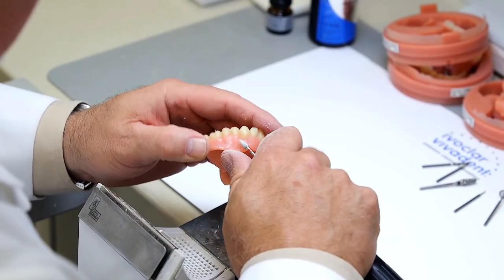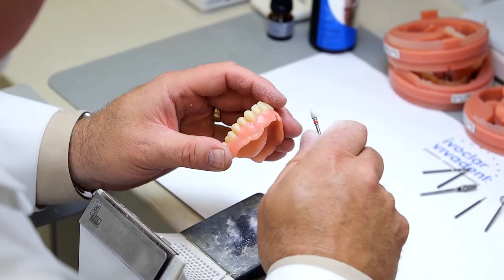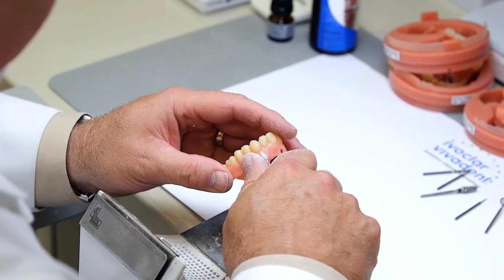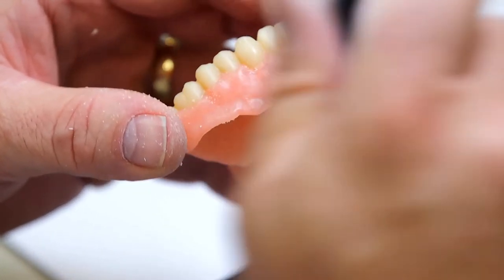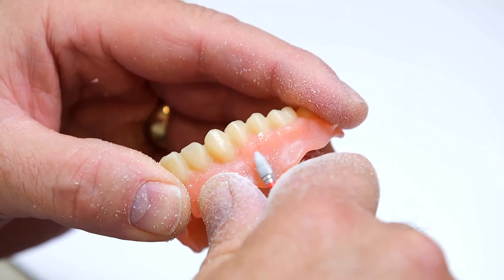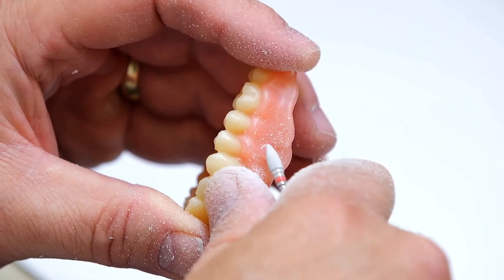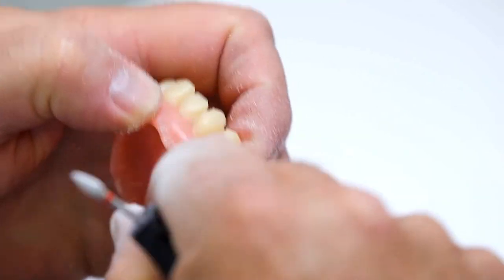So if you choose to add a little bit more gingival characterization, that's where this little pear burr also comes in handy. So you can come in and contour some of the denture base that maybe you didn't get around to doing in the CAD design. So that's another benefit of having this tool. So I'm multitasking the tool as I go for efficiency. Of course, you can turn your speed up to what you're comfortable with. Around 15,000 RPMs is typically where I work. It doesn't tend to burn the acrylic. So before I go to other polishing, I'm going to open up those embrasures.